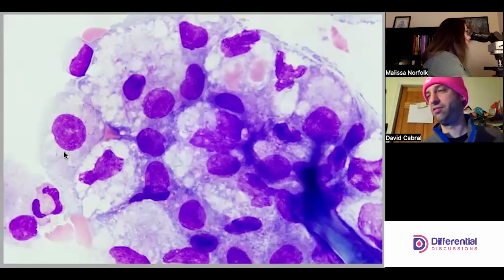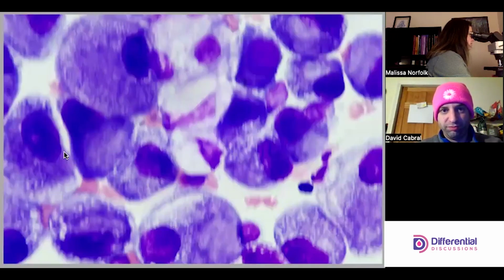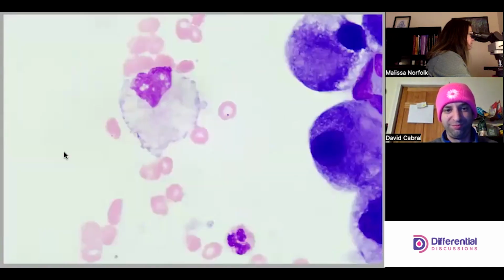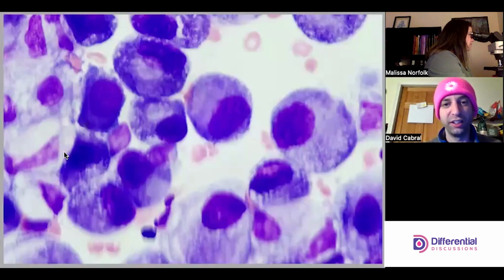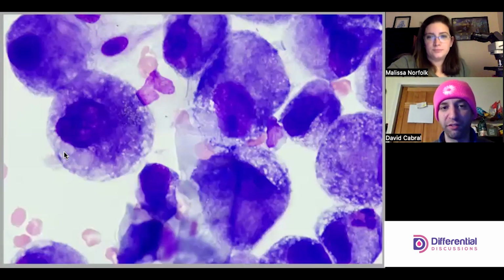Let's go back to the ugliness. Search in the other direction on that giant blob. See, just ugliness. So I think staining characteristics are important data points. Is there anything you want to take away from this?